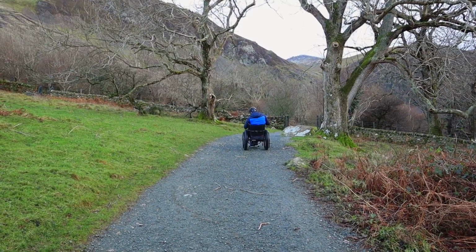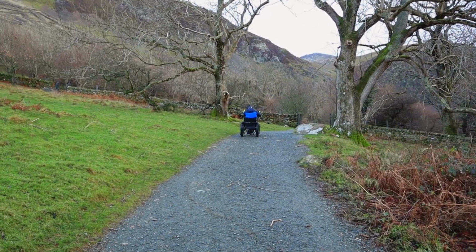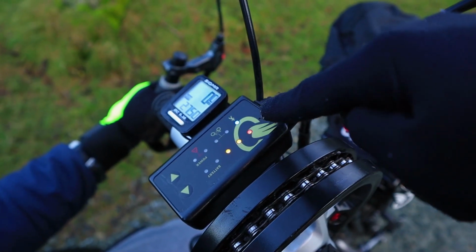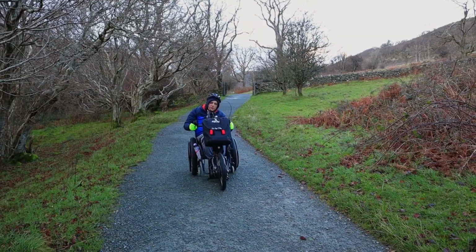So one thing we found that has improved the traction a little bit is, instead of trying to go straight up the hill, to zigzag like this. Going across the hill keeps the grip a little bit better than going straight up. Craig has been using this walk mode here on the Batec in today's test because I'm walking, so we're just testing out how well the walk mode can do.